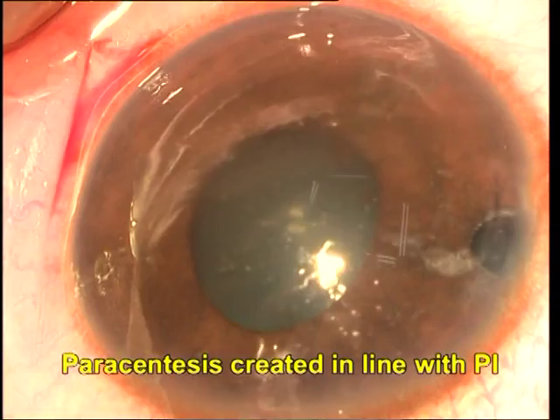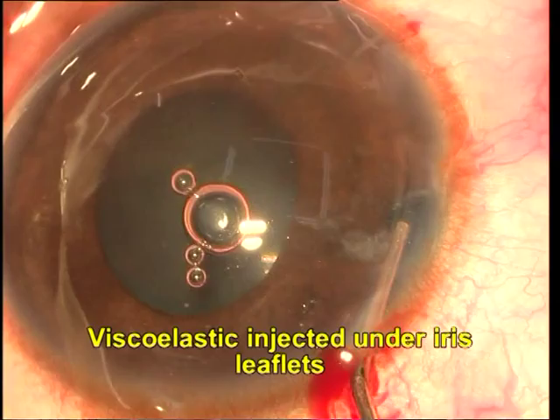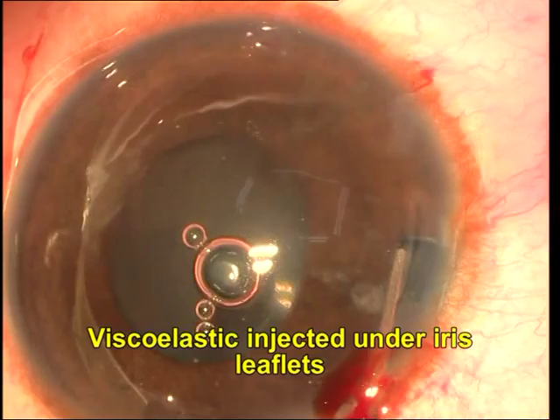The relatively large peripheral iridectomy led to glare and photophobia for the patient, as well as diplopia. The solution of course is to do an iridoplasty and decrease the size of the peripheral iridectomy. Extreme care needs to be taken in these cases.